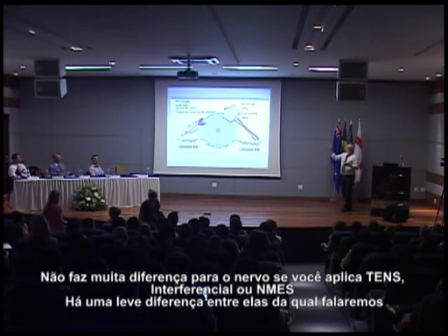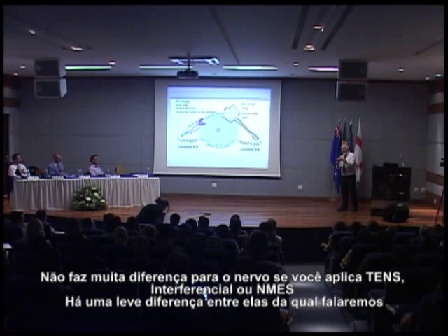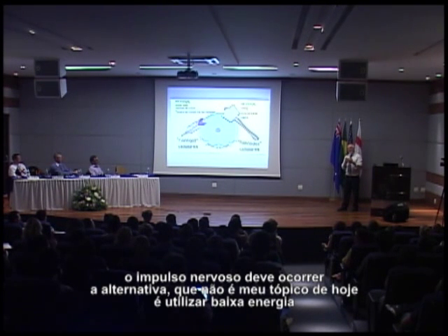The nerve doesn't really care very much whether you use TENS or interferential or NMES. There are slight differences between them, which we're all talking about, but your electrical stimulation simply forces a nerve to fire. The nerve has no choice, it must fire.